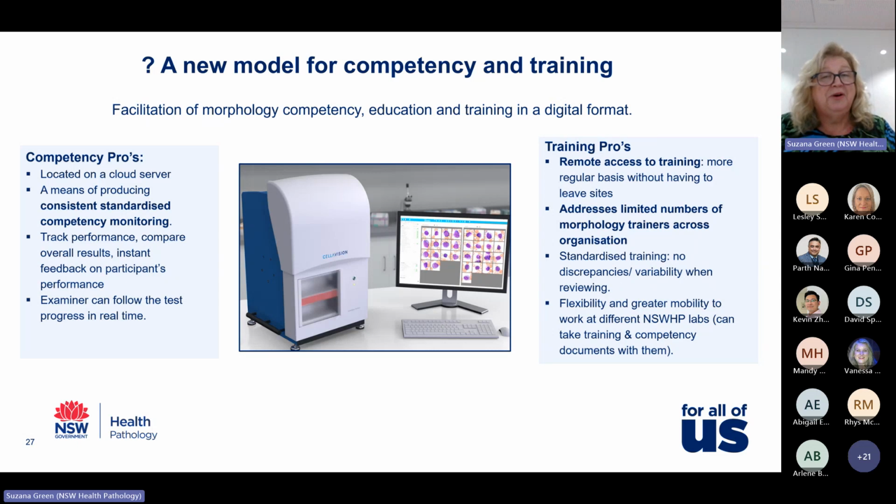So could this be a model for competency and training in the future? There's lots of pros, I believe, for using it as a competency tool. Firstly, it is in the cloud server, so there's little interference with our own computer systems. There's just having that consistent, standardized competency where you can actually see how they are answering and what knowledge they have, having it as a standardized approach. You can see, as I said, apples with apples.